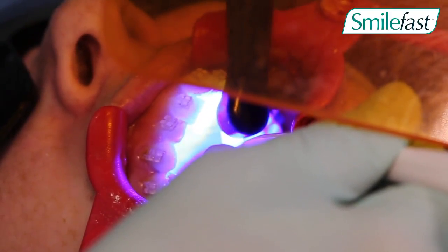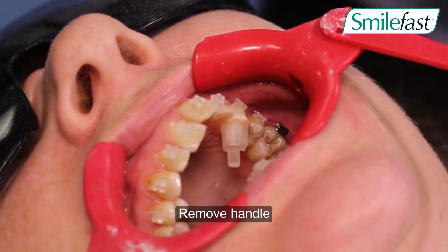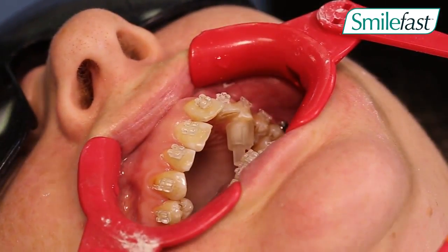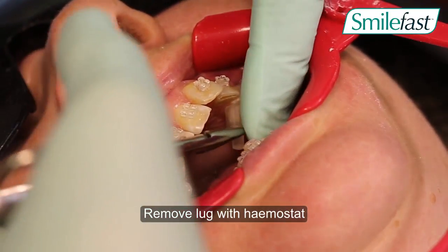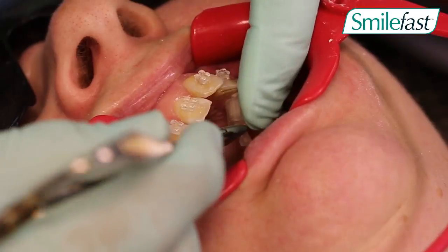The jig is then placed onto the tooth and cured at that position. These are made out of composite, so they are easy to either add to or to reduce the size of the bite turbos as required.